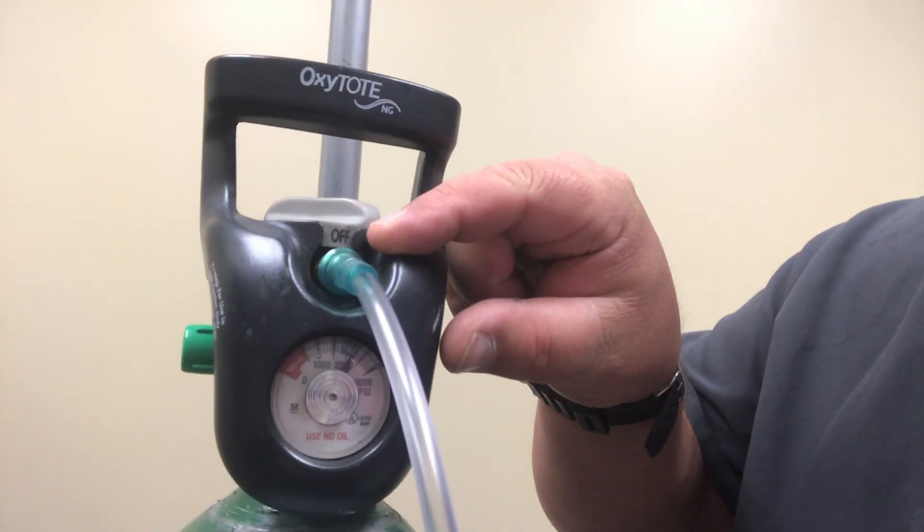The minimum amount of oxygen that can flow to a simple mask is six liters and the max is ten liters. The way we can tell how many liters per minute are flowing is by simply looking here, and it will tell us the liter flow per minute.